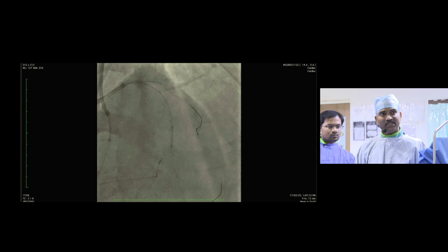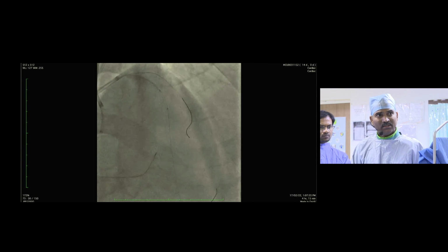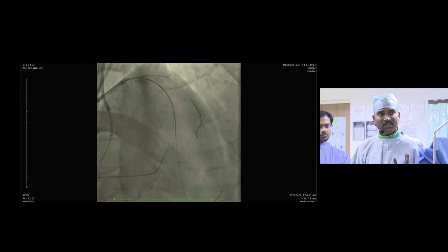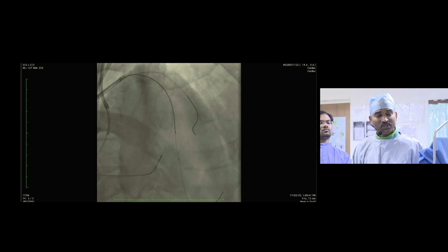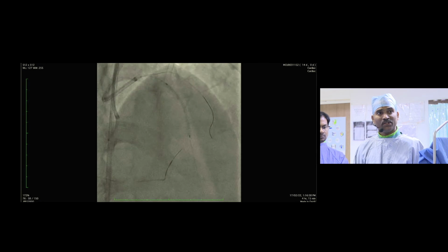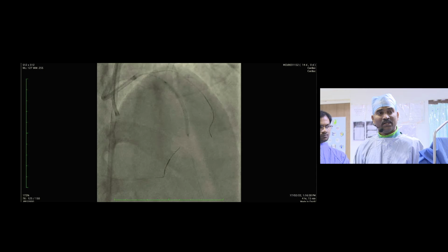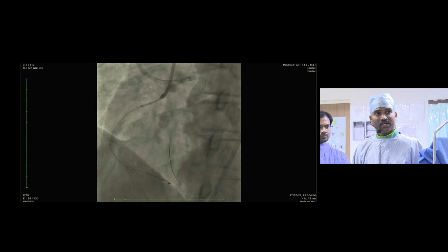We dilated further with a 2.5 mm balloon next, and you can see we did IVUS again to understand the entire vessel anatomy and which vessels are coming from true lumen and which vessels I may lose. I think the first diagonal is something which I'm going to lose. At this stage, once you take the stent in, you have to pull the retrograde wire back into septal, and we dilated a 2.75 by 38 mm stent. So we pulled the retrograde system out.